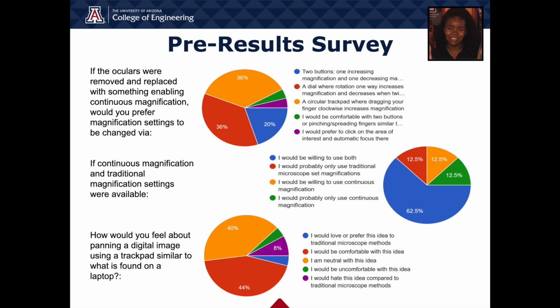And since the beginning of this project, our goal was to build and deliver a product that would ultimately meet our customer needs. In order to decide which design features would best satisfy our customer and also ensure our product would be accepted on the market, we surveyed 25 pathologists and other slide readers.